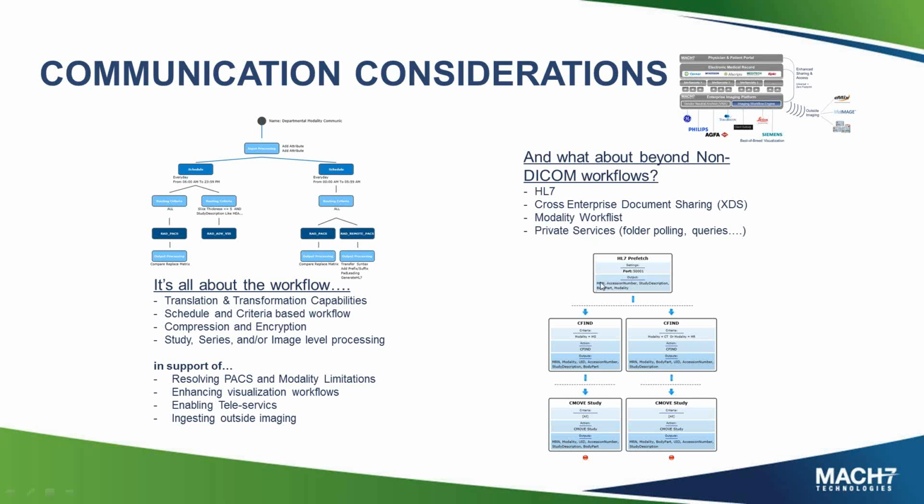So whether it be HL7, I've talked quite a bit about patient updates and merges. Maybe it's HL7 triggering prefetch workflows. Maybe it's XDS or modality work list. And it's interesting, modality work list, I'm sure most of you already have a DICOM modality work list solution, but what about non-DICOM sources? Do you have a solution for brokering patients and visits so that dermatology and wound care can see a pick list similar to what you see in radiology?